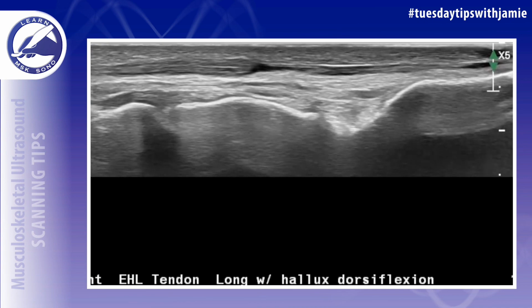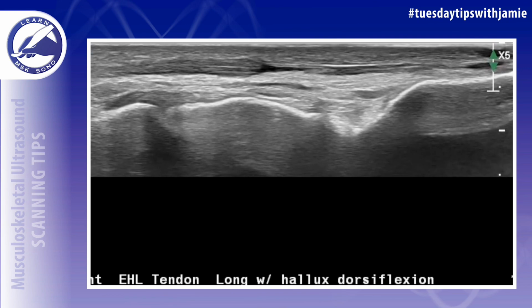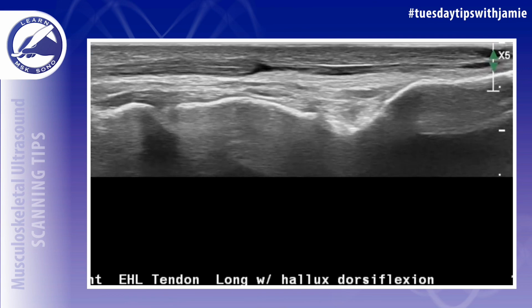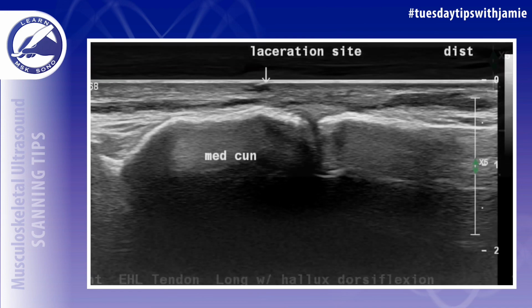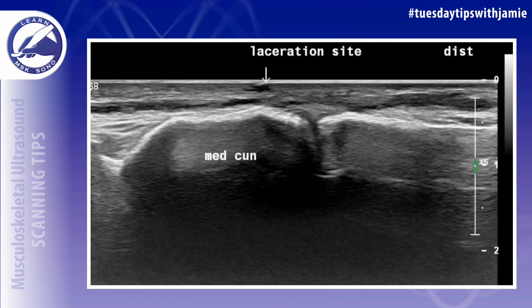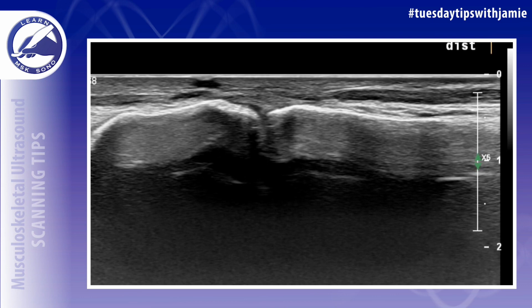Sometimes bleeding from a torn tendon can be hard to recognize. Acutely, anechoic fluid may be visible within the tear, but over time the echogenicity increases, making it easy to mistake complex fluid for tendon fibers. You have to entirely sweep through the tendon in the long and the short axis to be able to visualize a break in the tendon in any segment and to determine the extent of injury.